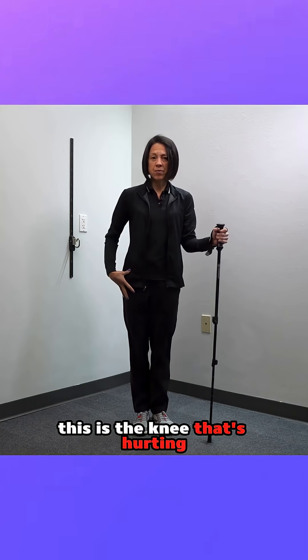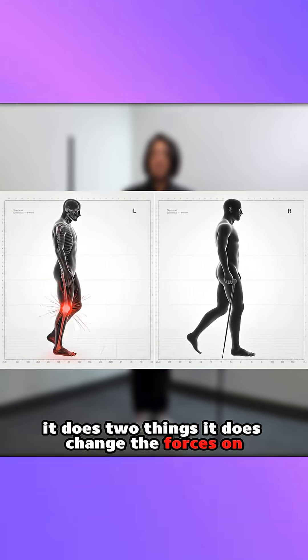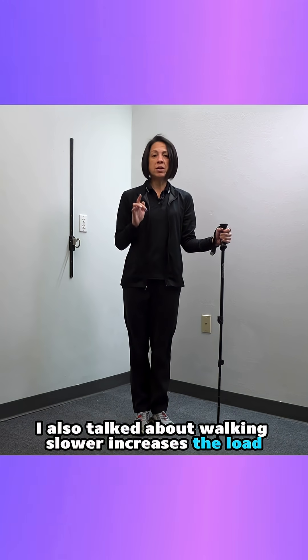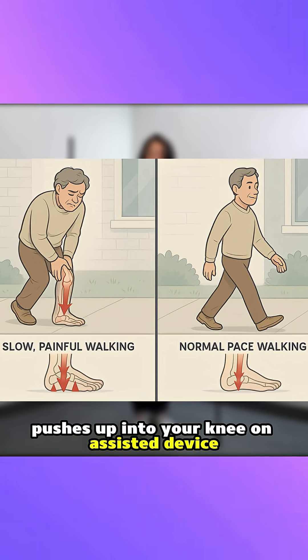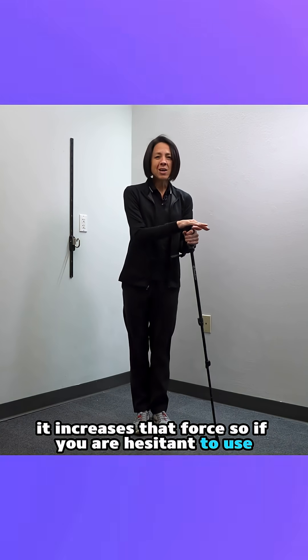If this is the knee that's hurting, use an assistive device in the opposite hand. It does two things: it changes the forces on the knee, which we'll go over in a minute, but also remember that walking slower increases the load — the ground reaction force, the force that comes up through your foot and the plate pushes up into your knee. It increases that force.